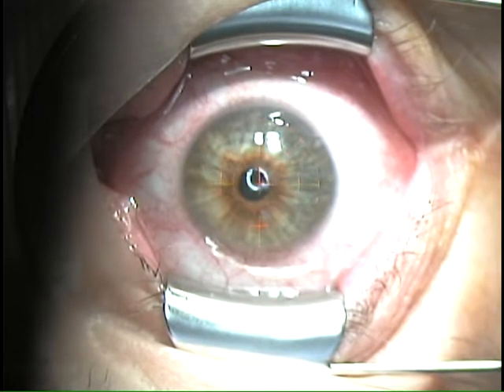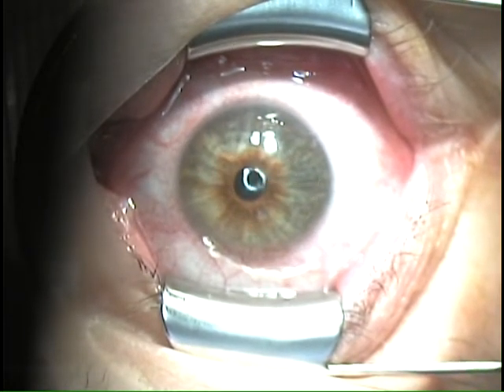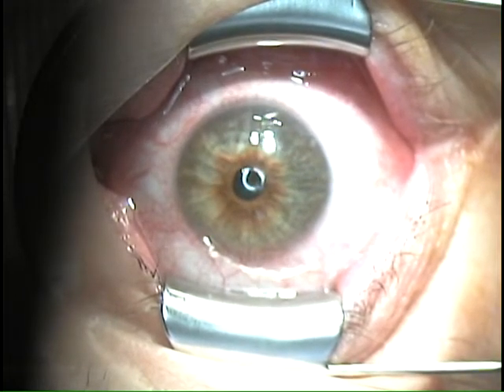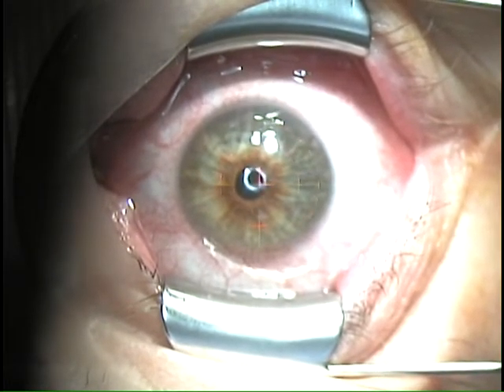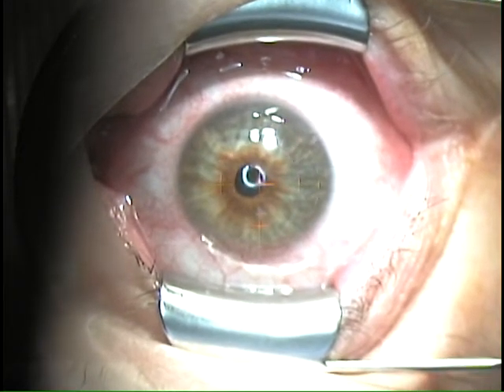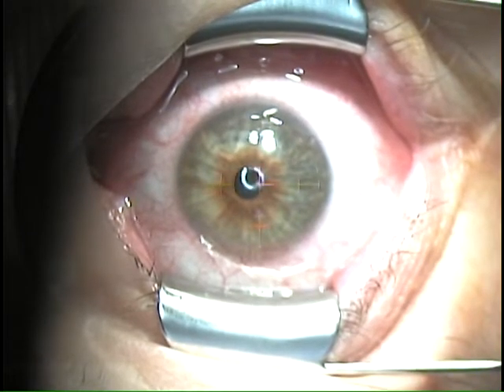We're doing an enhancement in the right eye. The prescription is plus 1.25, plus 63 at 10, 250 pulses, 26 seconds, 17 microns. We used ablation diameters 9mm, correction diameters 5mm. Auto-tracking will be enabled. We've already started the engagement of the flap, which was previously done in this procedure, and we'll show you that in a second.